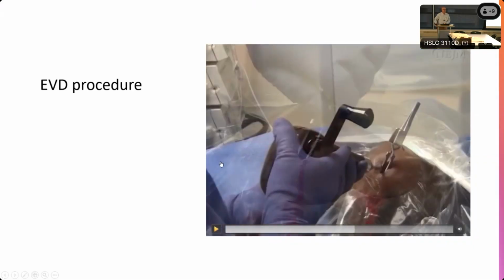What do you think was wrong there? We usually use the end of the pickups or put a little thin piece of gauze down and then scrape with the pickups. Whatever works. They said they were doing a 3 centimeter incision, but that's obviously not. That's why the retractor is a problem in this case. Usually I make it big enough so the retractor can actually do something.